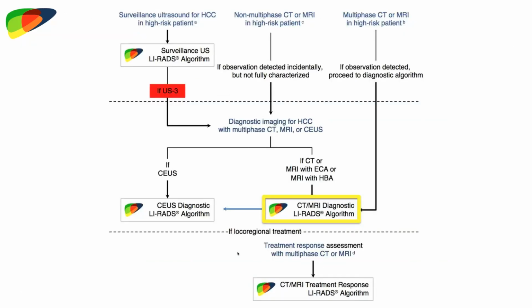The other workflow I'd like to talk about that had been mentioned earlier this week is when a patient comes to CT or MRI for a diagnostic study, and that diagnostic study for some reason may not provide all the answers. Either it was degraded by motion or artifacts, the contrast timing was poor, or an observation wasn't completely characterized. Again, I think a modality that can be considered is contrast-enhanced ultrasound.